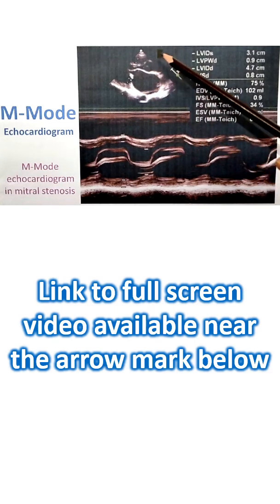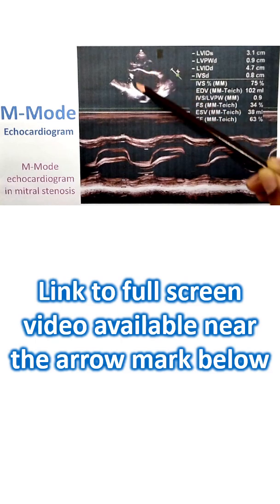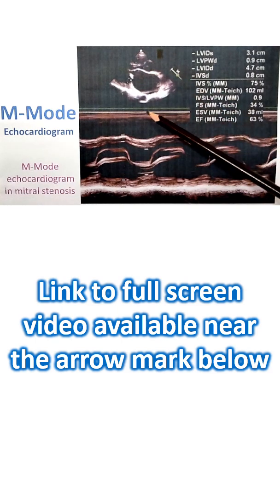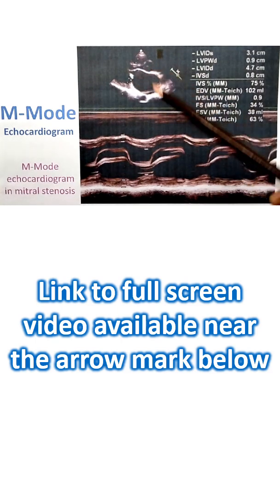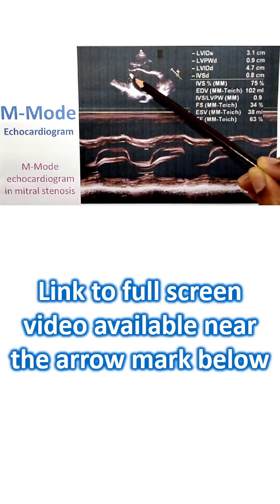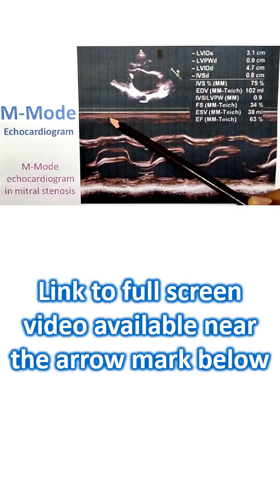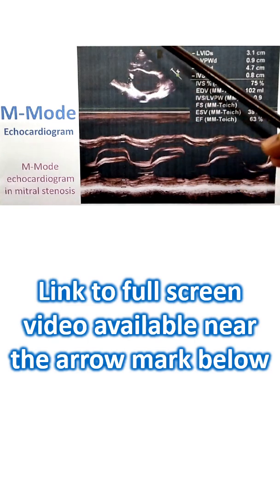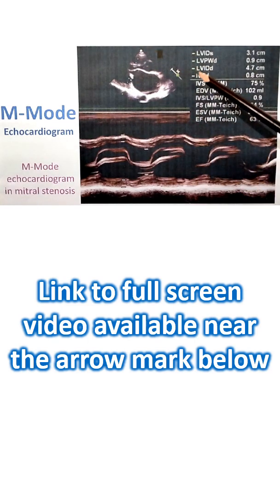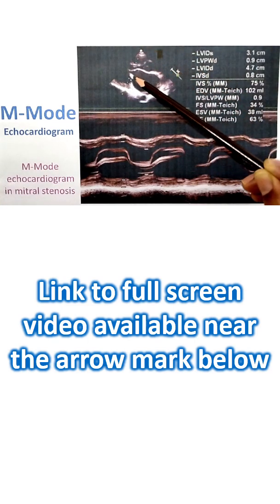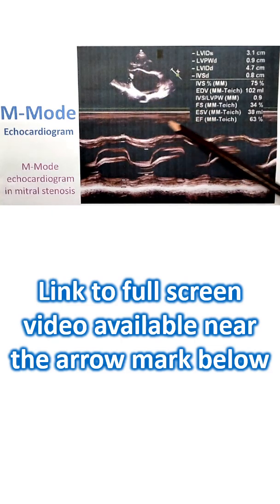Usually this is the aorta; aortic diameter and left atrial diameter are almost similar. This is grossly dilated because of mitral stenosis. And you can see that the posterior leaflet instead of opening in diastole has moved upwards. That is paradoxical anterior motion of the posterior mitral leaflet.